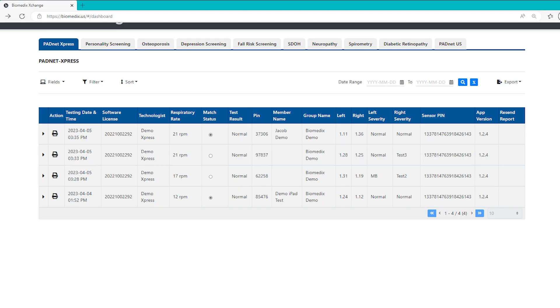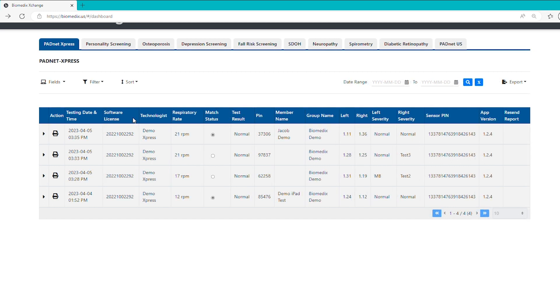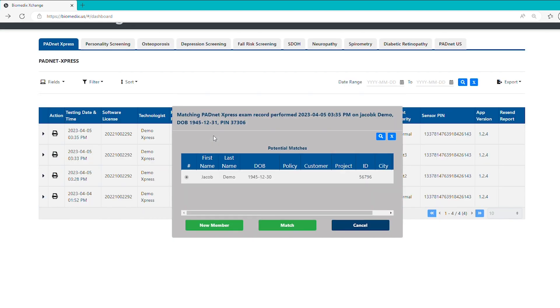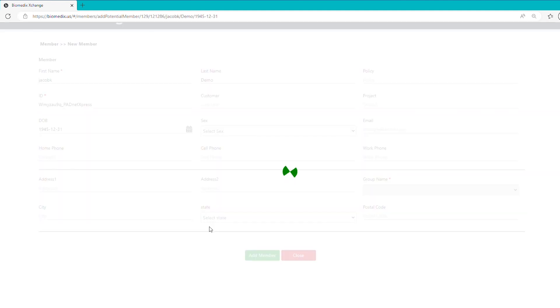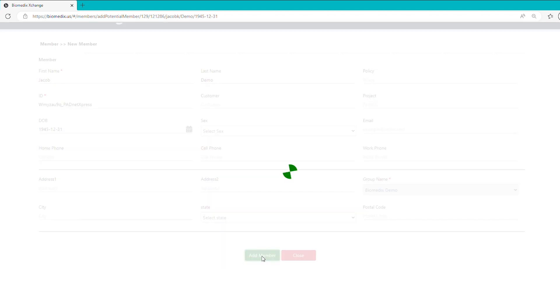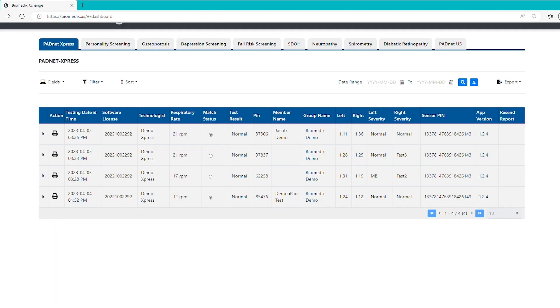In the Exchange website, you will see a list of all completed tests from your connected devices. To load a test with patient information, simply select the Match Status button and the service will automatically attempt to match your test to a patient record based on the test member name and date of birth. If no options are available or relevant, you may select the New Member button to add new member information instead. Hitting save will load that information onto the final report, which can be accessed by hitting the print icon to the left of the test.